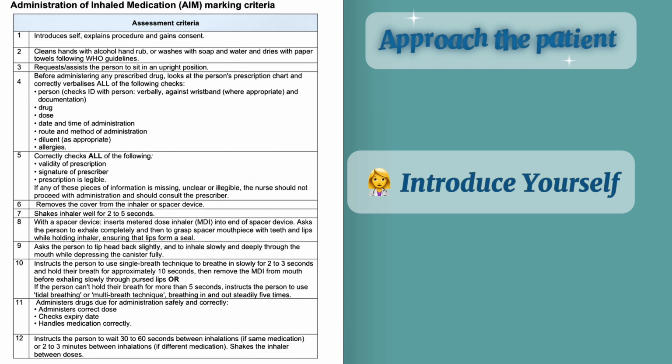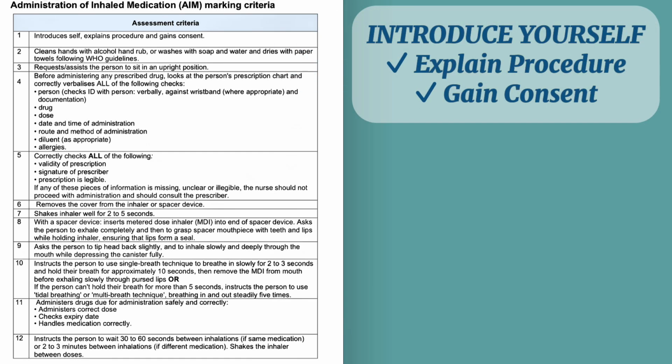Hi, my name is Nurse Sarah. I'm going to look after you today. I'm here to administer your inhaled medication, which is according to the prescription. Would it be okay? Before I start, can I just confirm your ID check, please? Would it be alright? Can I just touch your wristband?